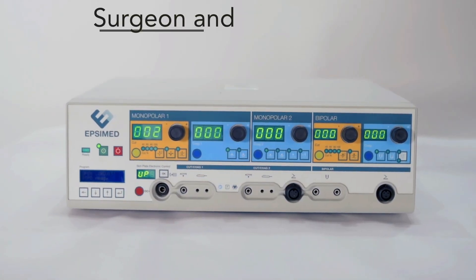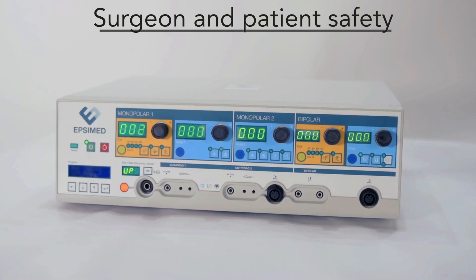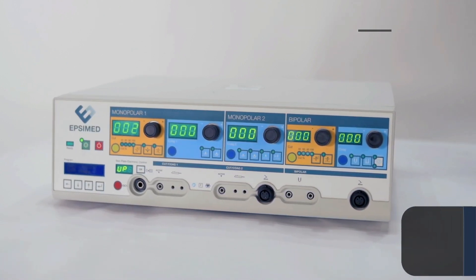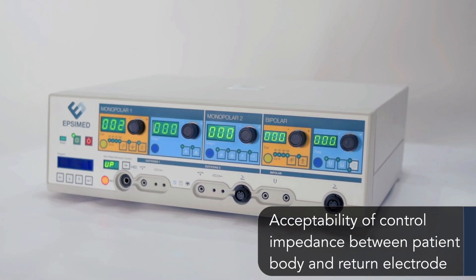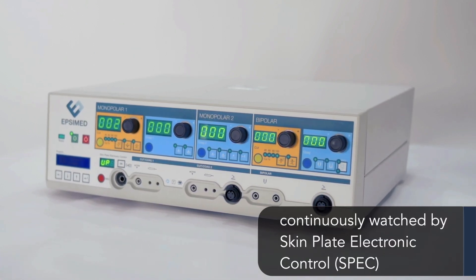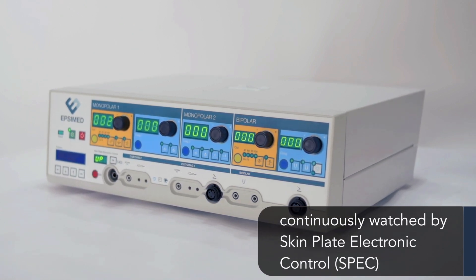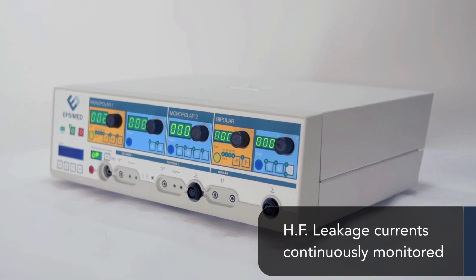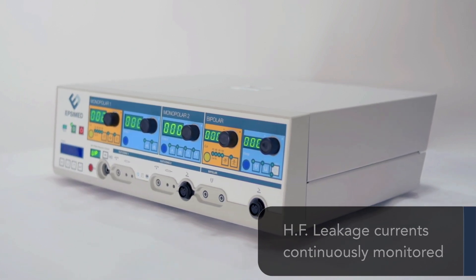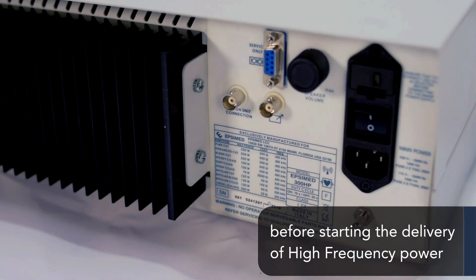Surgeon and patient safety are the equipment's most valuable features. These include acceptability of control impedance between the patient body and return electrode, continuously monitored by skin plate electronic control, HF leakage currents continuously monitored, and mains fluctuation automatically compensated before starting the delivery of high frequency power.